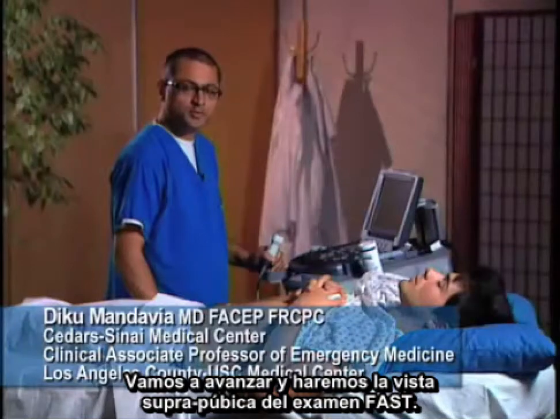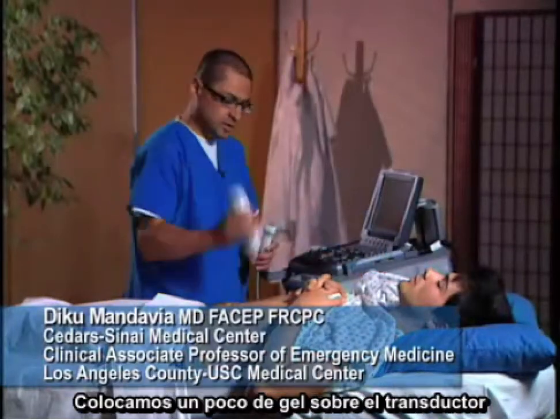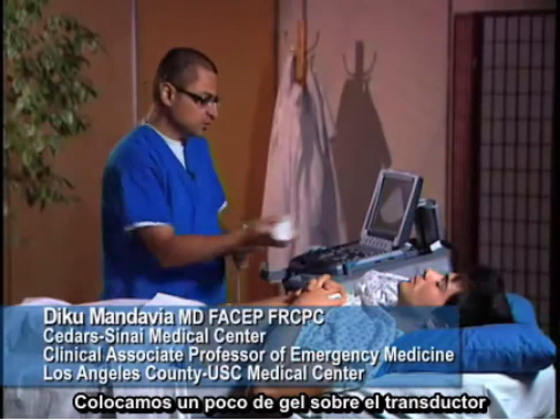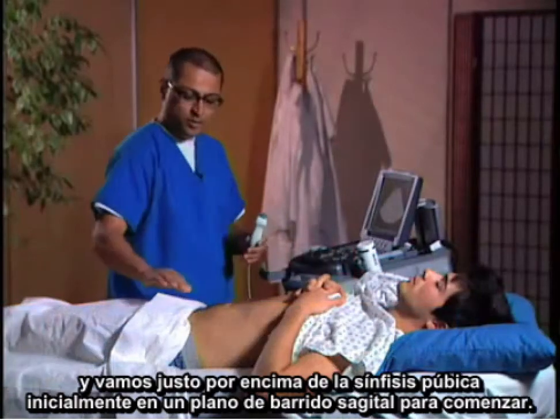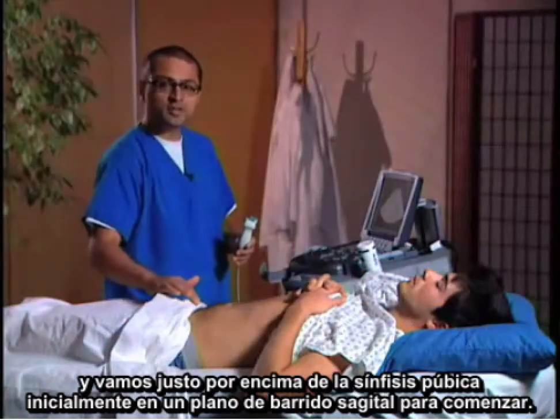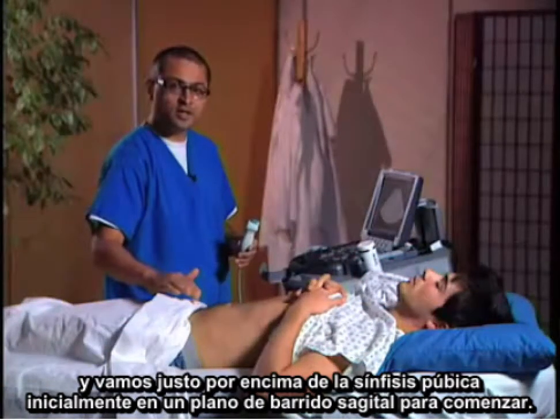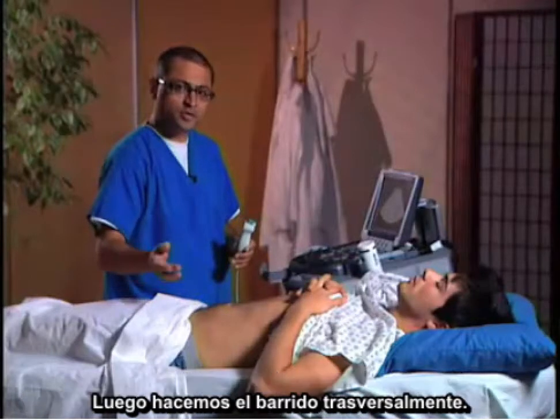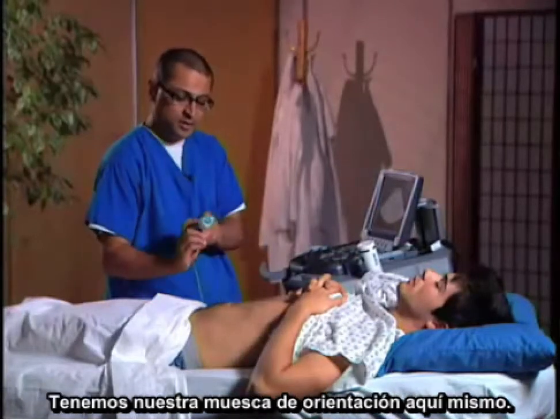We're going to go ahead and do the suprapubic view of the FAST exam. We're going to put a little gel on this transducer, and we're going to go just above the symphysis pubis. We're going to start initially sagittally, and then we're going to scan transversely.